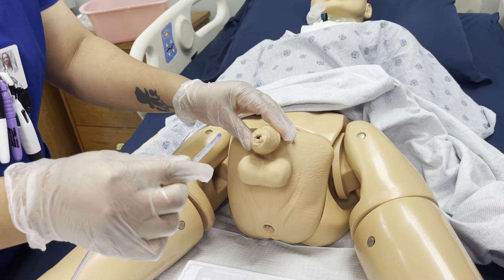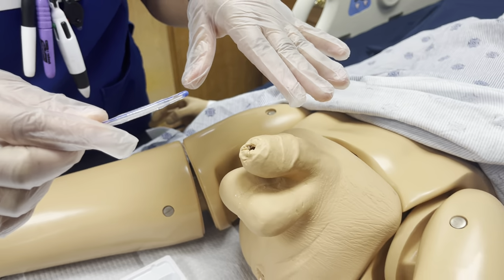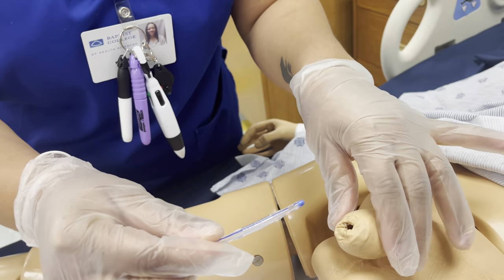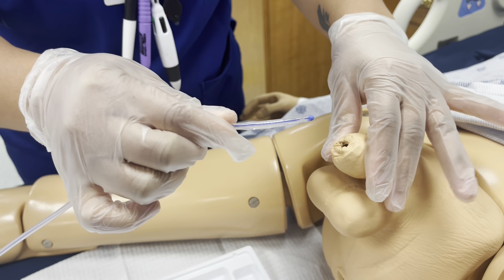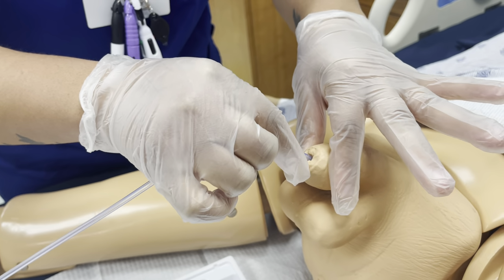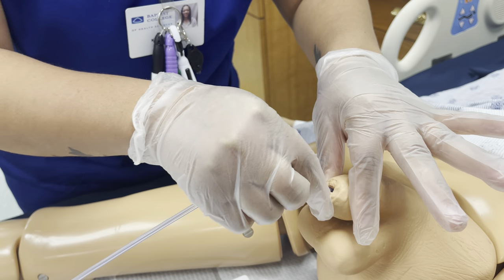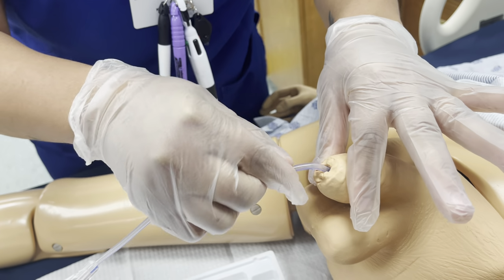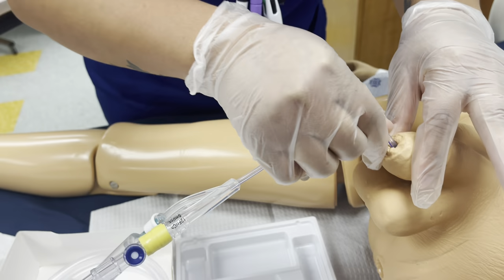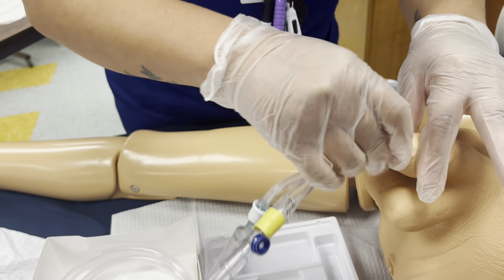Okay, Mr. Manning, I'm going to get you to breathe in. His nose is running. You scared, Mr. Manning? I'm scared. Now I'm going to insert, going all the way in, three to four inches. You see pee, right? No, that's for the female. For the male, you go all the way down. I'm going all the way in, Mr. Manning. Are you okay? Okay, we're almost there, Mr. Manning.